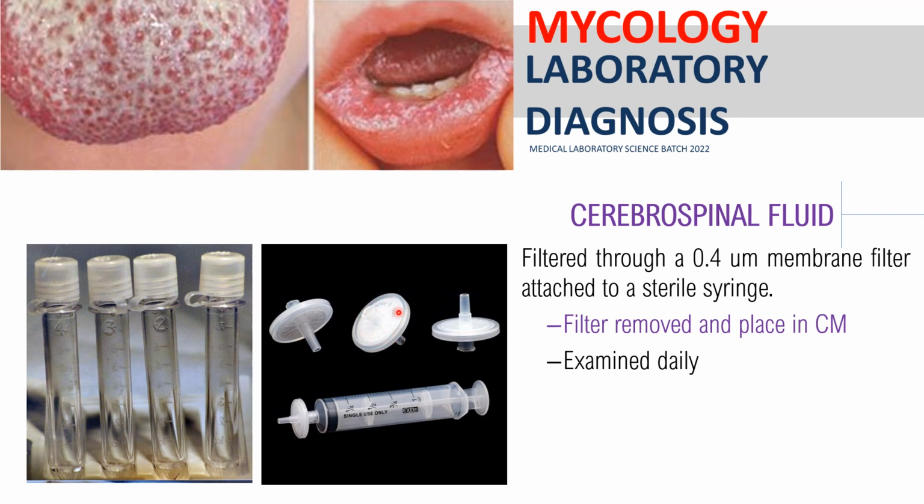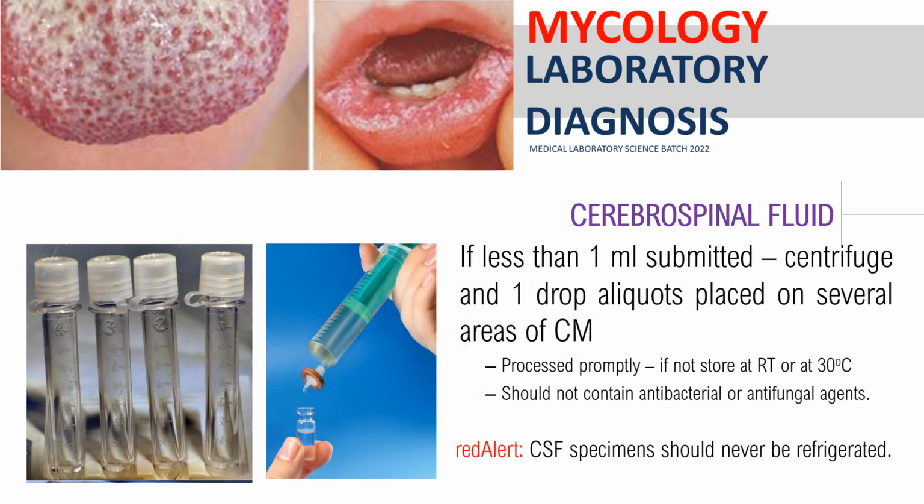So matatrap siya dito sa filter. Pag natrap siya sa filter, i-open mo tong filter class. Tapos pag open mo, ilalagay mo siya sa culture media, CM. Filter, remove, and place to culture media. According to Baylis and Scott class, pag ginamit mo filter, dapat everyday lalagay mo siya into different place of your culture media. And then, examine everyday or daily. Pero class, yun yung nabanggit ko kanina, yung pinaka-common talaga for the processing of your CSF is centrifuge.